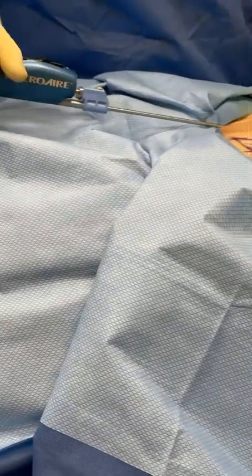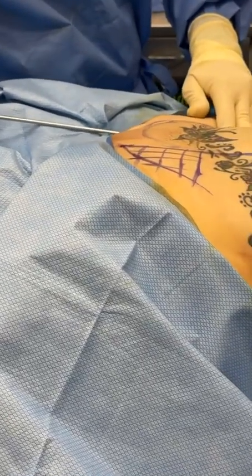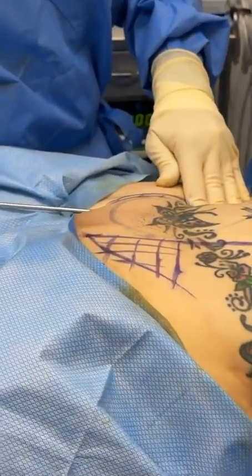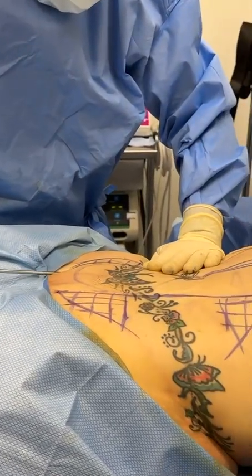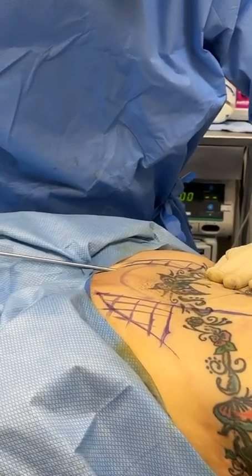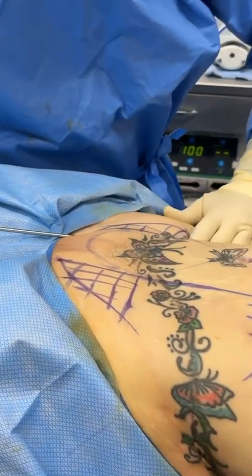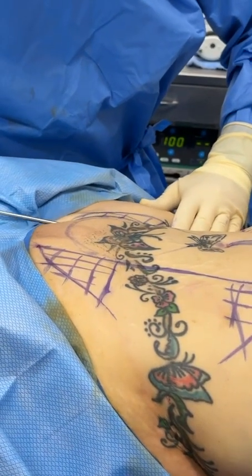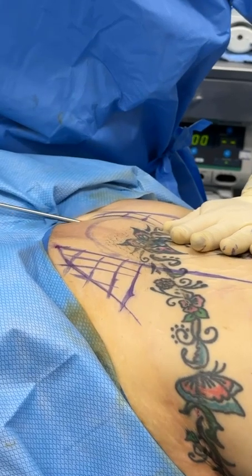And so that provides for, number one, safety, right? It's going to be very hard for me to perforate an organ. Very hard for me to perforate an organ if I am doing this so slowly and so controlled, right? And I'm pressing down here for those doctors watching out there to get deep. This is a Mercedes 4mm cannula.